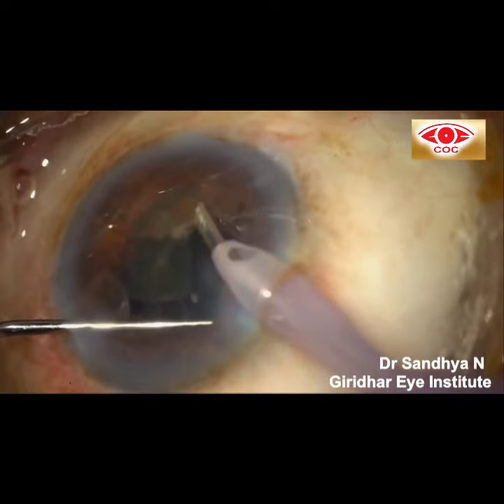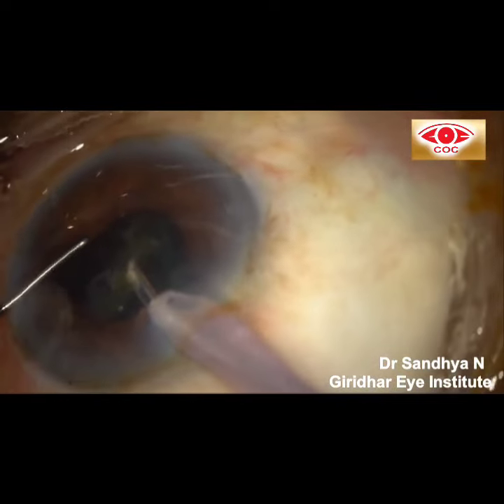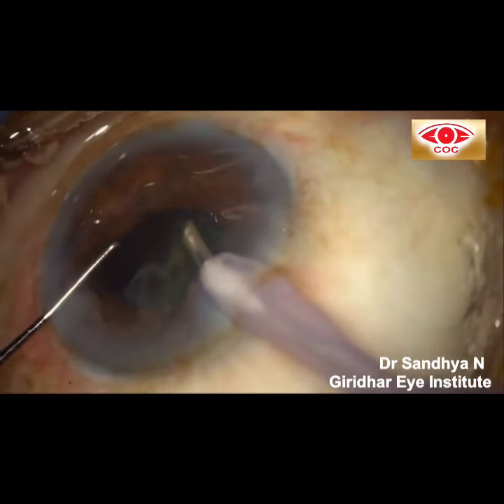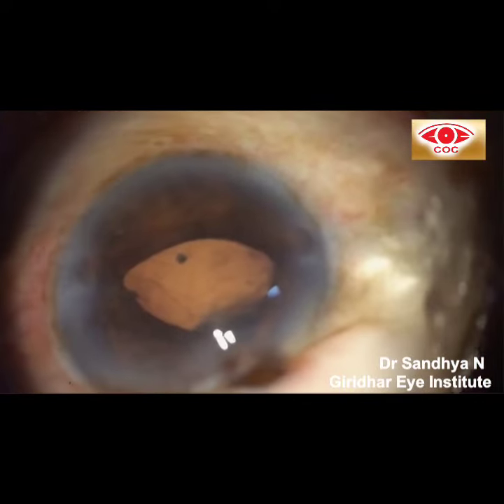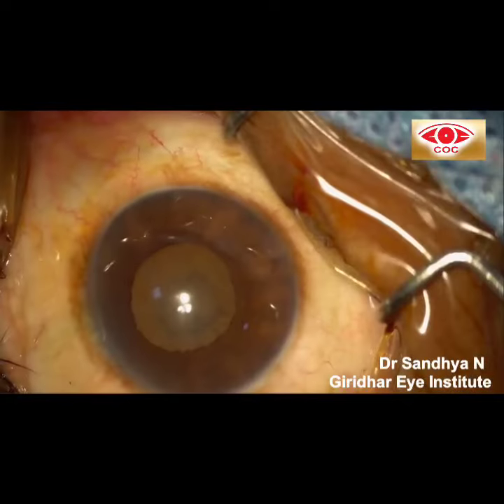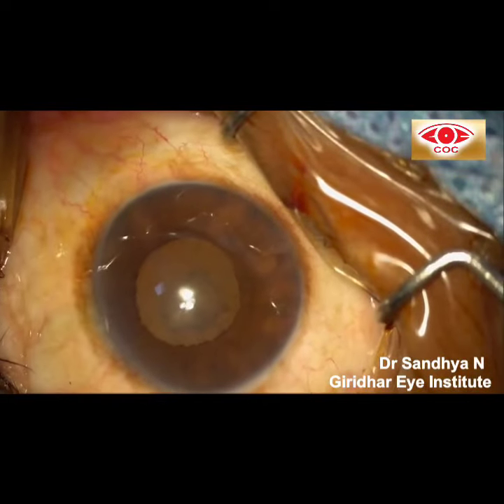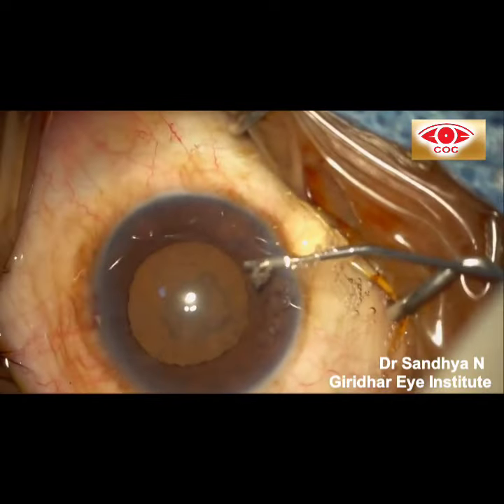IFIS is characterized by billowing of iris, progressive intraoperative miosis, and prolapse of iris through corneal incisions during phacoemulsification. Though classically described with tamsulosin, it is associated with various other medications and clinical conditions including hypertension. This was a patient on tamsulosin and the pupil was just mid-dilated. Adrenaline was injected to dilate the pupil.